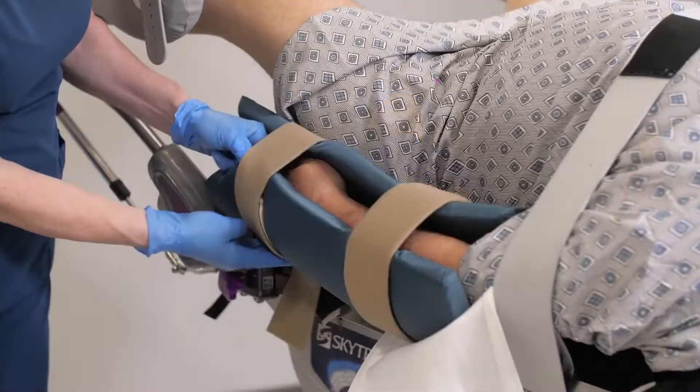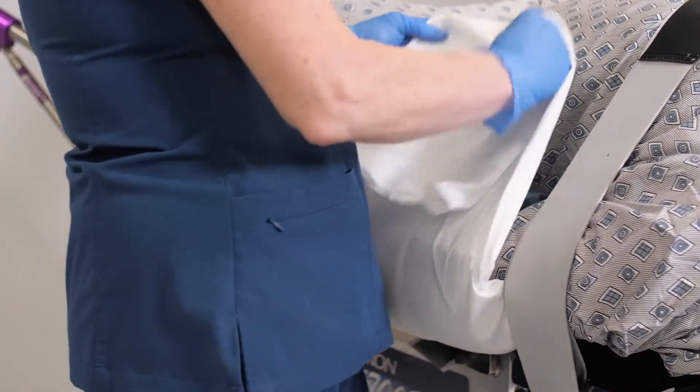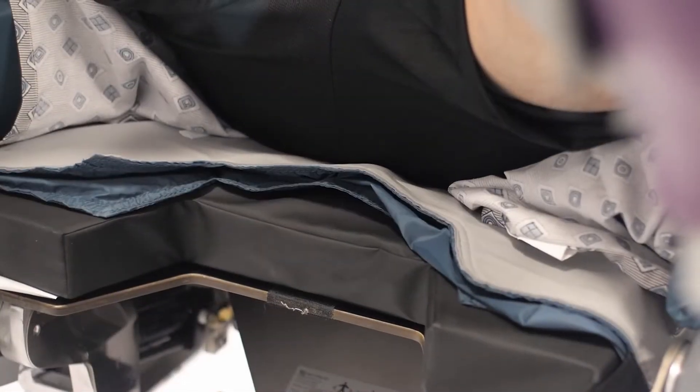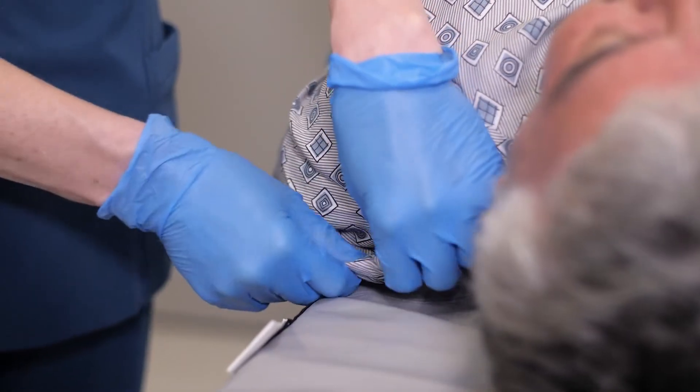Confirm that the Hovermat T-Berg is flat prior to the patient getting into position. Ensure that the patient's arms and fingers are protected and secured to the body — it is important to protect the ulnar nerve and fingers. Make sure the patient's buttocks region is as close as possible to the bottom of the mat. The patient's skin should be in direct contact with the holdfast foam for maximum patient stability.